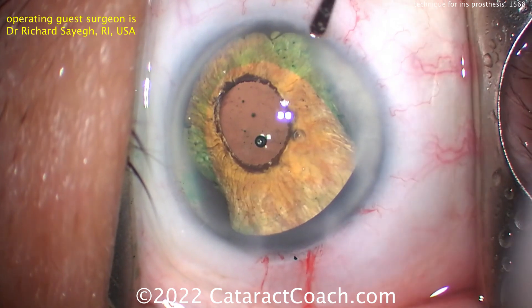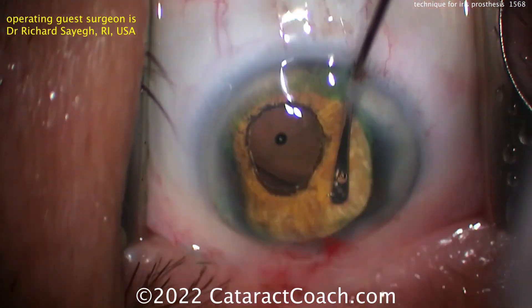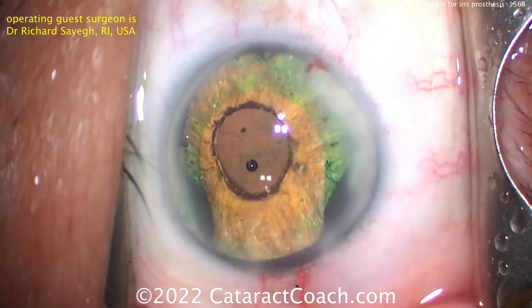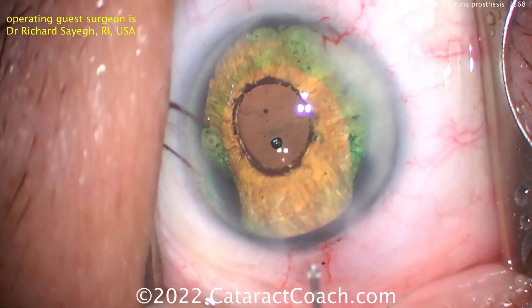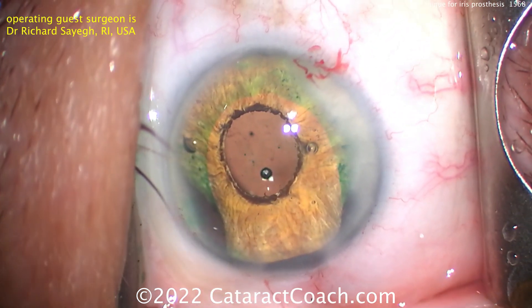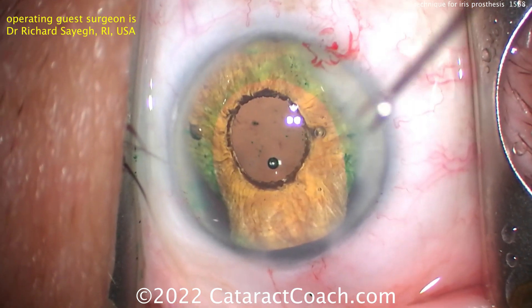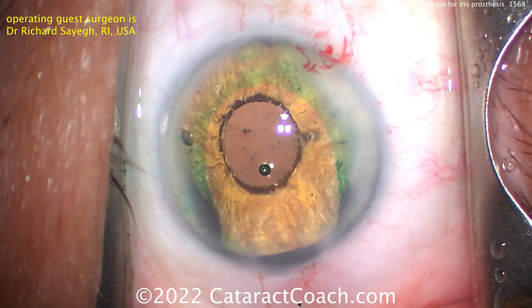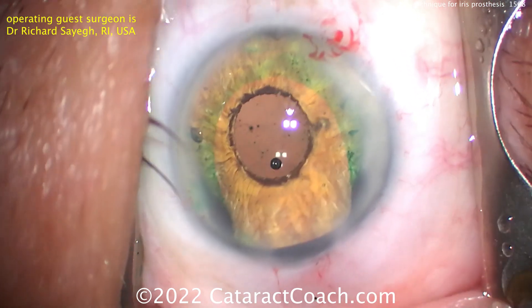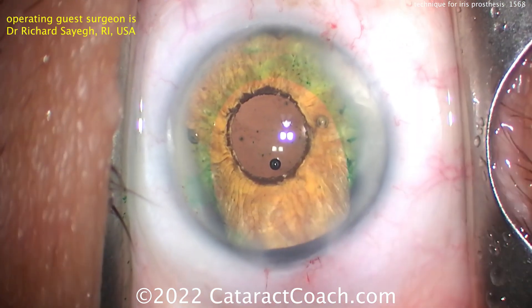A lot of people have done great work with these prosthetic irises and given us good information on how to implant them. It's a little bit bulky, and you've got to be very careful — the anterior lens capsule is only about 14 microns on average, so it's very thin. A smart move here: extra viscoelastic going inside to keep the eye completely inflated. Now the micro forceps go opposite the main incision, about 180 degrees, to grab the pupil margin and retract it into the capsular bag.